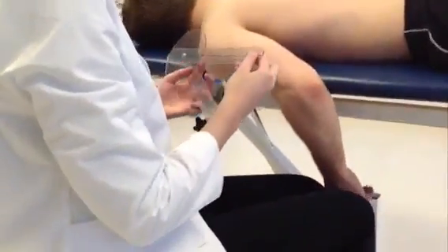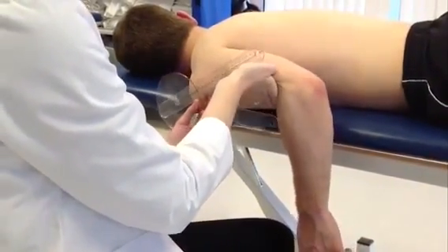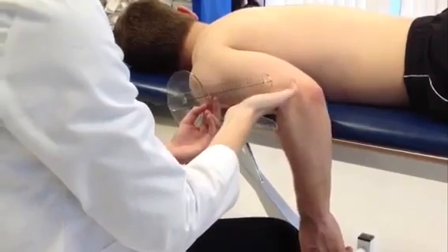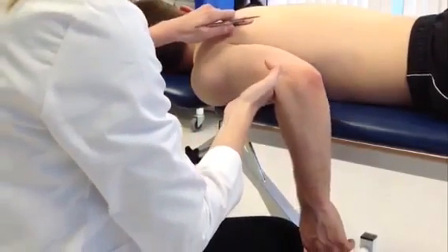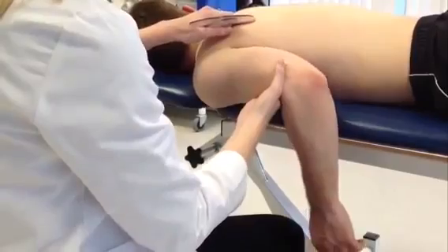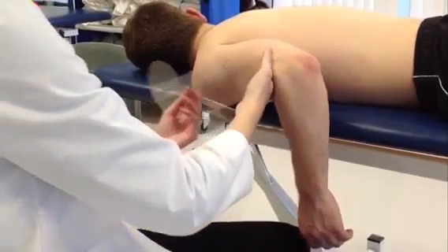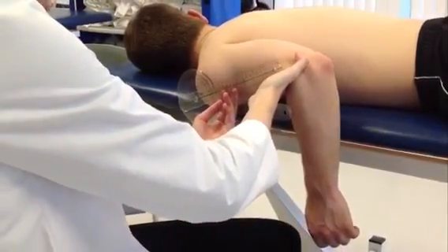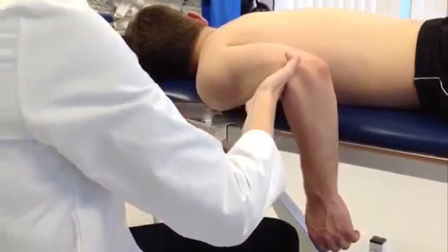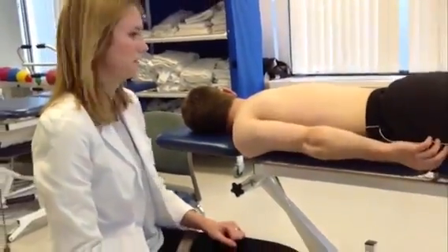So this time I'm going to measure it, doing it passively for you, so I can just relax. And I'll line up my goniometer. Alright. Just relax your weight until, there you go. Right there. Okay, I get 16 degrees of passive motion, and the normal value that you'd expect for glenohumeral extension is 20 degrees of motion.